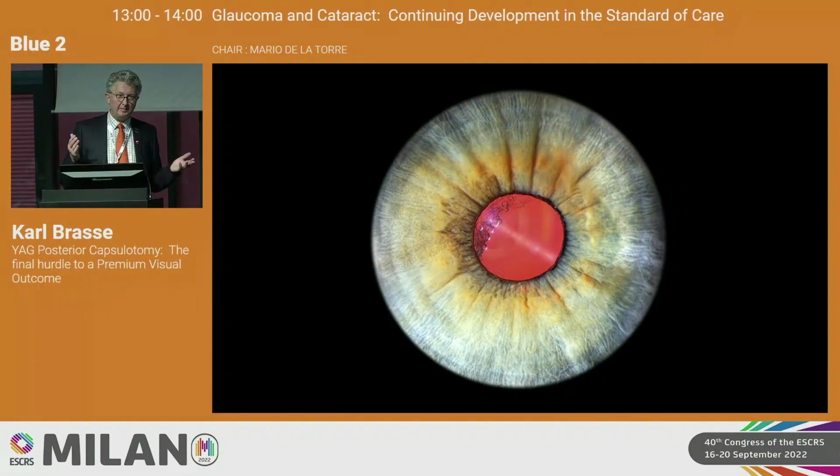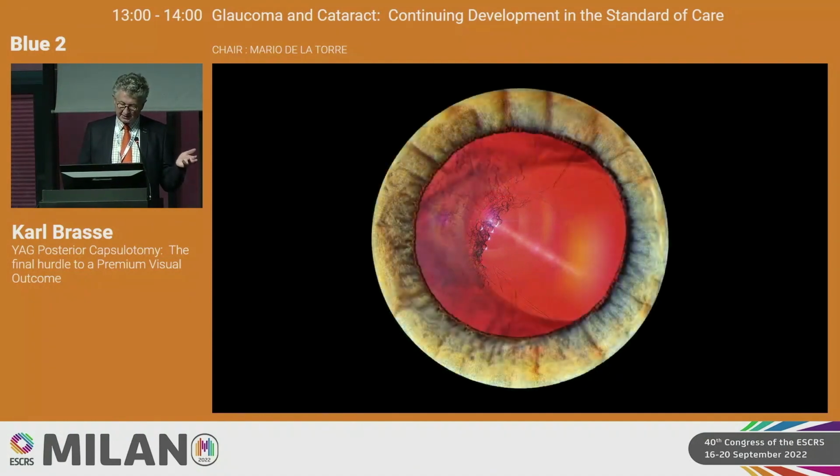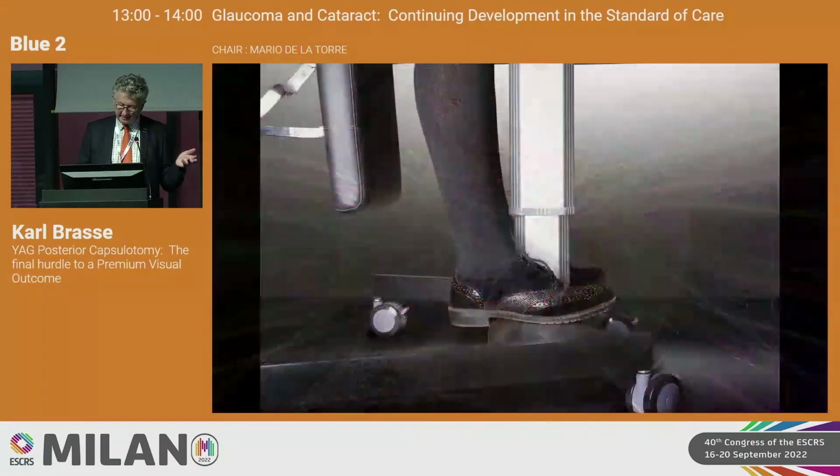I showed you, and let me show you a few more cases. If you do it primarily, I've shown you the technique. We have a new lens now with the broader diameter. The new laser has a posterior offset of 2 millimeters. And there is a group of patients that can benefit from your knowledge. I call that a reshape. I'll just go through the cases right now to save time. This is an unhappy patient. I did a reshape.